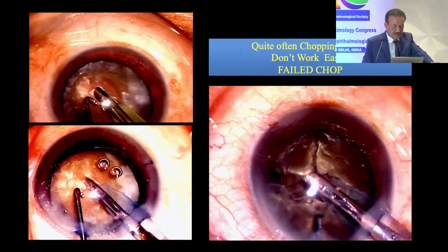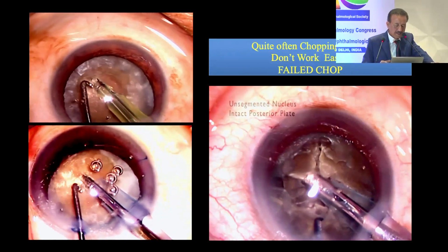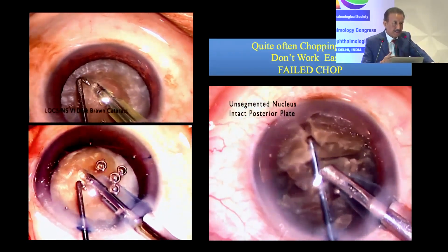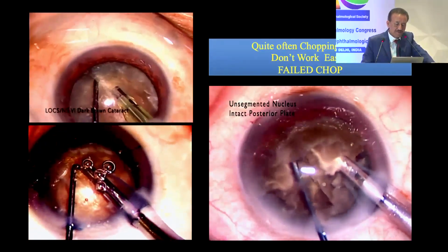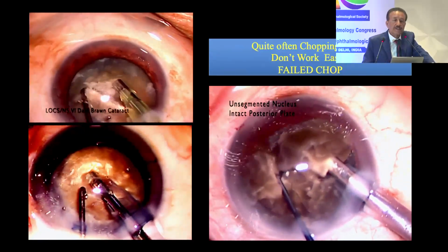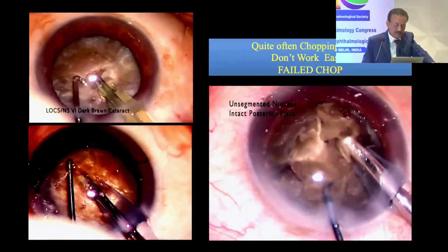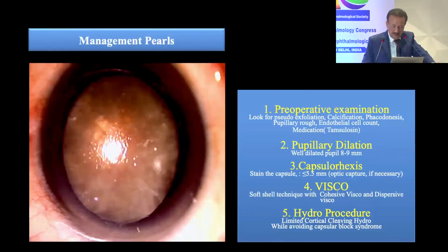Sorry. Okay. As you can see here, in many of these hard nuclei you don't get the crack, and if you don't get the crack, you are left with the undivided nucleus, and then the manipulation becomes too much because taking these pieces out on the phaco probe becomes very difficult. So you have to use a lot of second instruments, and that is the time you may get into problems with the capsule, cornea, and so many things. So I'll take you through the simple management of this very hard cataract, and the points you should remember when dealing with it.